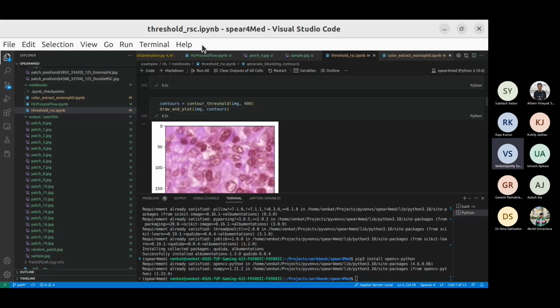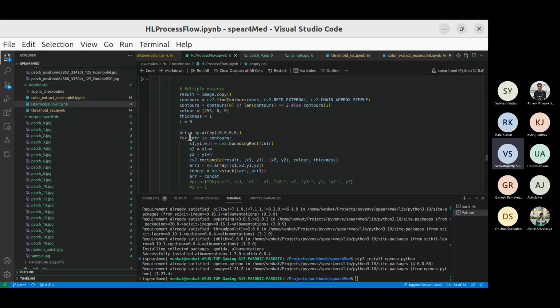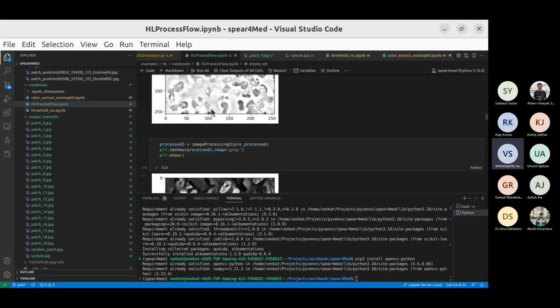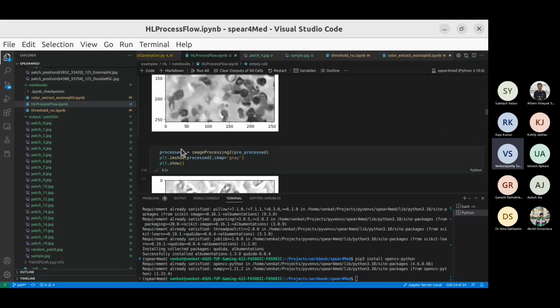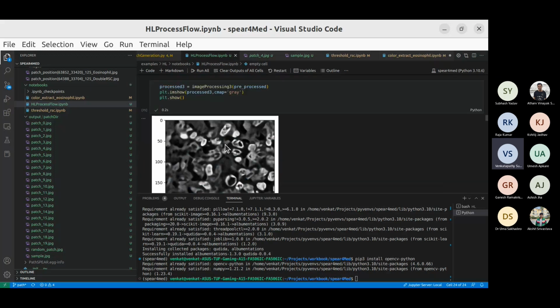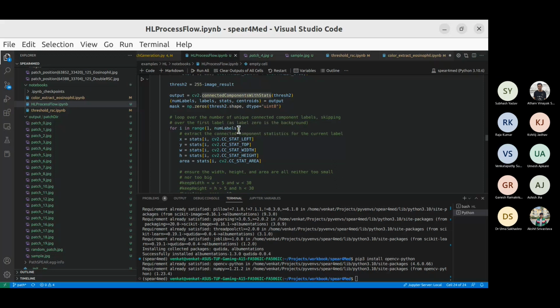I wanted to show you, maybe it is not technical, but let's just take how we are doing it. We do some pre-processing. You can see we take the same patch in different shades, and for each of those shades, we run this labeling function based on a heuristic approach. There is something called connected components.